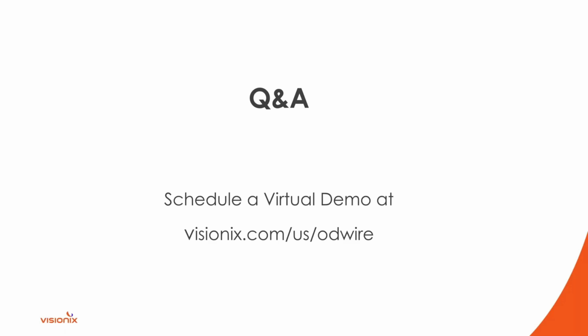Compare and contrast the Solix to the Avanti. So how long do we have? For a long time. I do know that one of your other webinars, Dr. Rodman, goes into that a little bit. The scan patterns have been improved. And of course, the Solix has multimodal capabilities that the Avanti didn't have: IR imaging, external color imaging, the full range of capabilities with the anterior chamber and retinal scans. And then, of course, fundus camera.